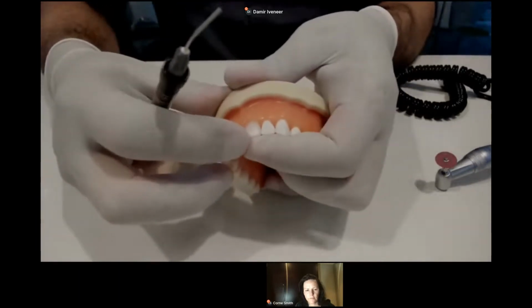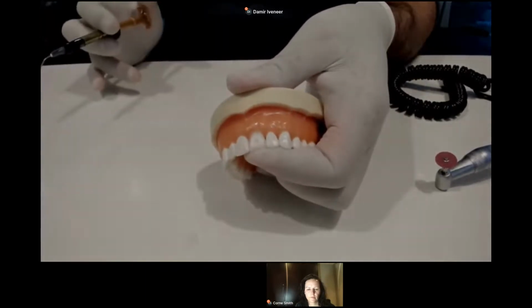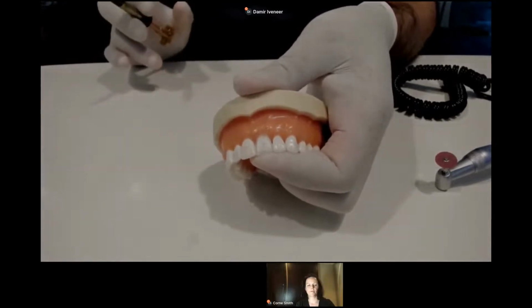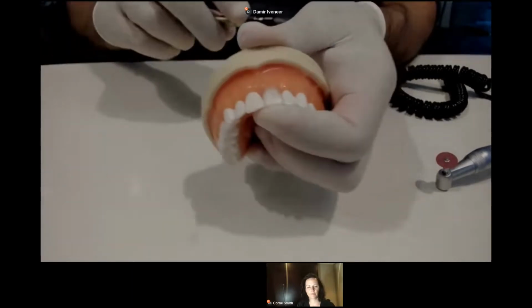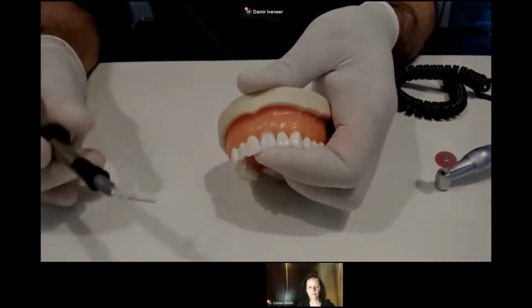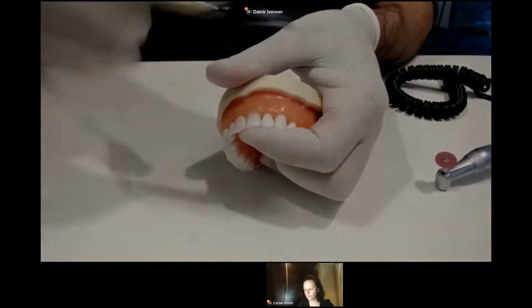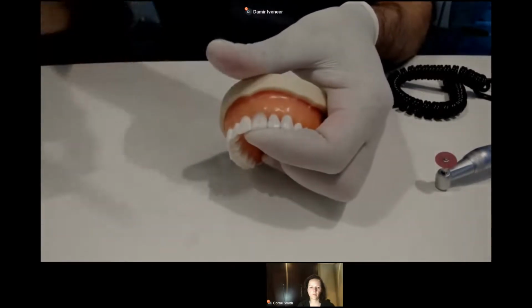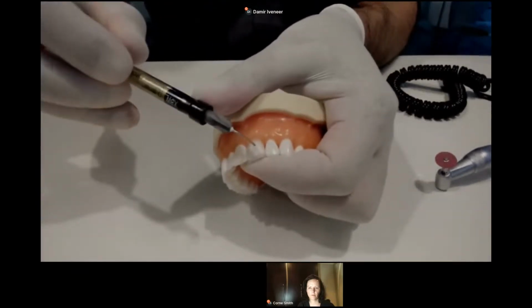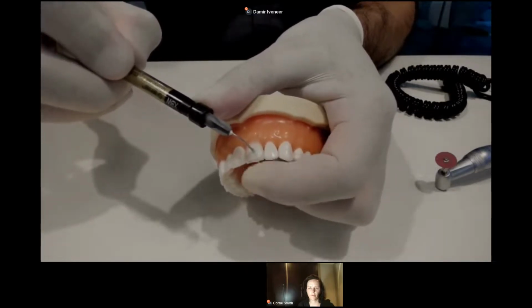So while we inject the material, after we close everything, I can block with my finger, or as I told you, I can block from behind and cure it freehand. But let's say that I'm blocking with my finger right now, okay? Then I take the syringe. The tip should be at almost 90 degrees, because when we inject, we don't want to push the matrix with the tip and move the matrix. We want it to be very passive. We support with our thumb. We put the flowable composite, and can you see the injection? We inject, inject, inject, okay?